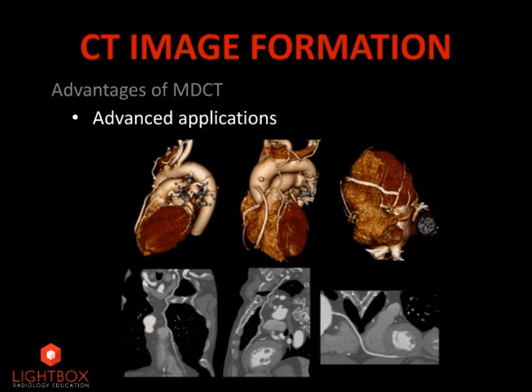As a result of the technological advancements in CT, advanced diagnostic applications have evolved. CT coronary angiography is a good example of this. Improvements in both spatial and temporal resolution have optimized diagnostic image quality. CT coronary angiography is a powerful screening tool in assessment for coronary artery disease.